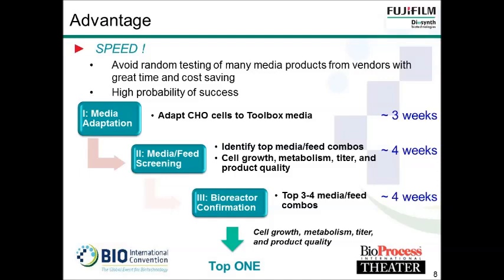So almost every year, or maybe 2 or 3 years, media vendors launch new products. But efficiency wise, you may not want to test all of them. That's why we want to do this. Based on experience at Fujifilm, we have achieved pretty good success stories behind this, and we feel good about the high probability of success about it.